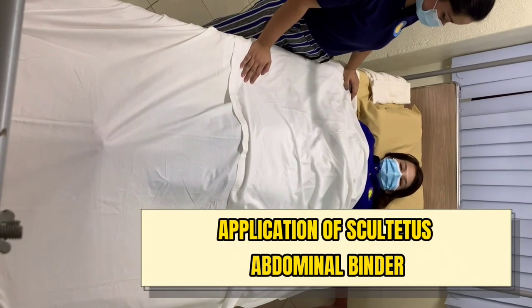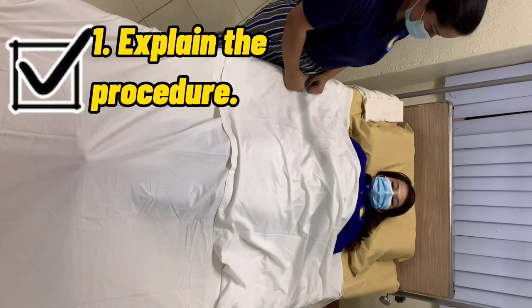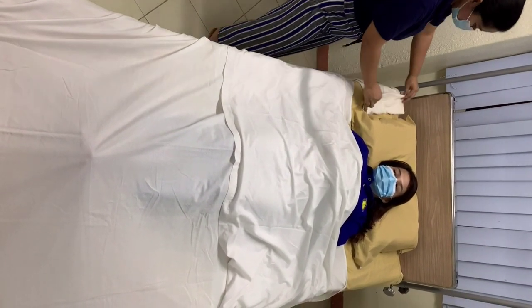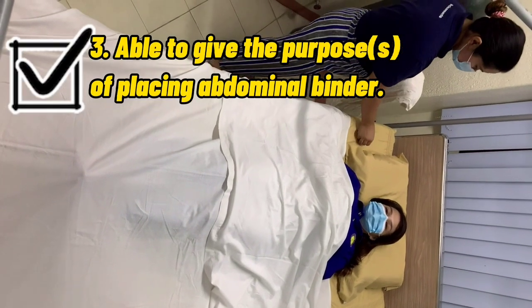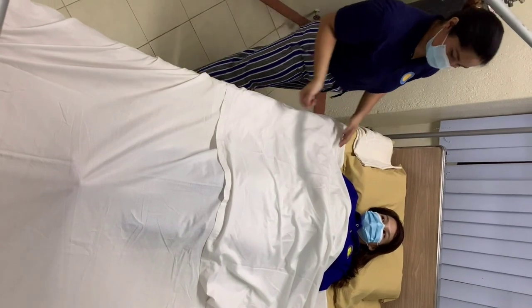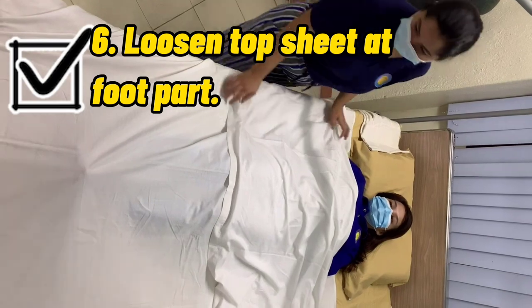Application of the Scultetus Abdominal Binder for OB surgical clients. Explain the procedure, prepare the needed equipment, and be able to give the purpose of placing the abdominal binder. Wash hands and wear gloves if necessary. Provide patient privacy and loosen the top sheet at the foot part.